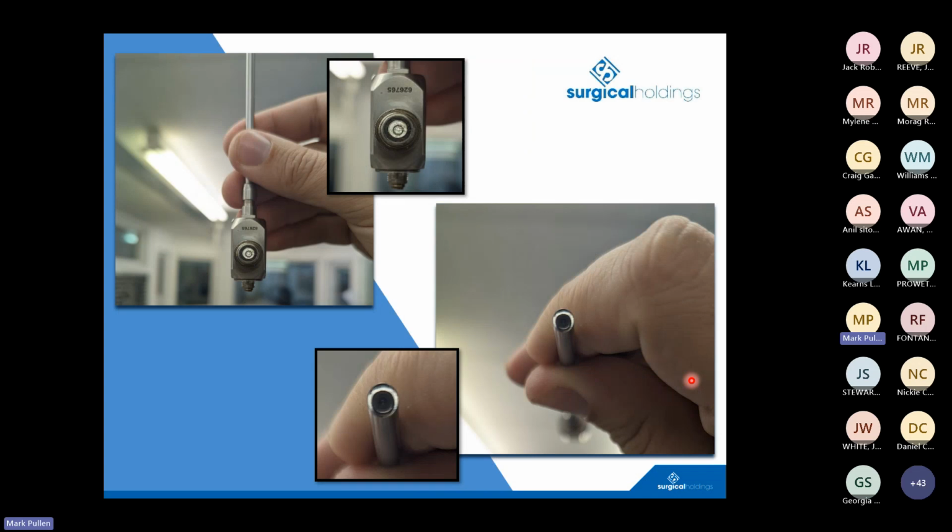And here's our test again. So holding the distal tip up to a light, you can see the light post here, transferring that light down, again, no broken fibers. And then on the reverse, holding the light post up to the distal tip.